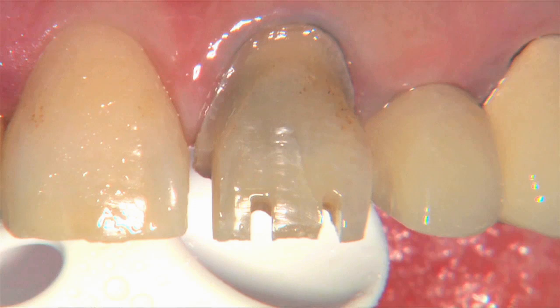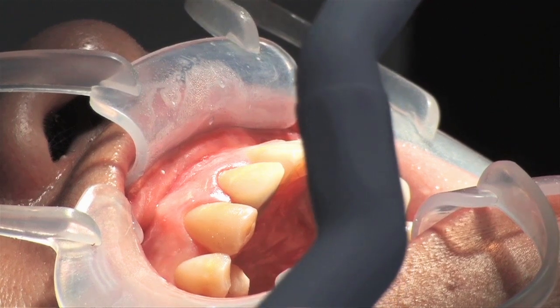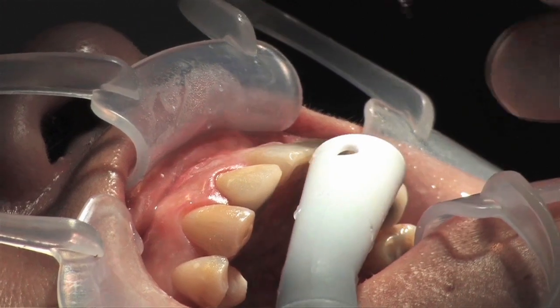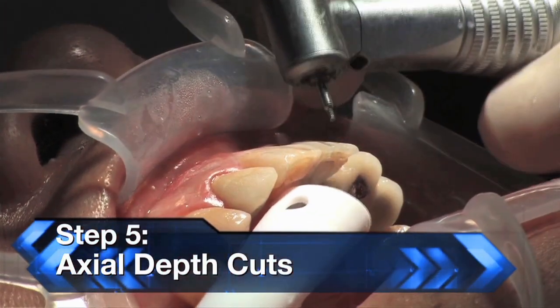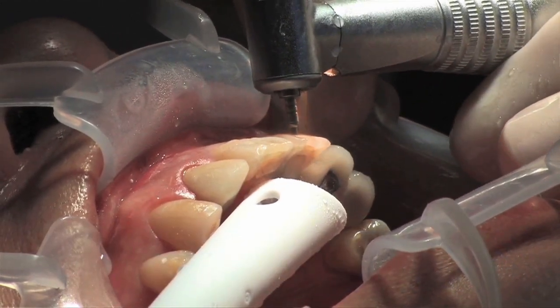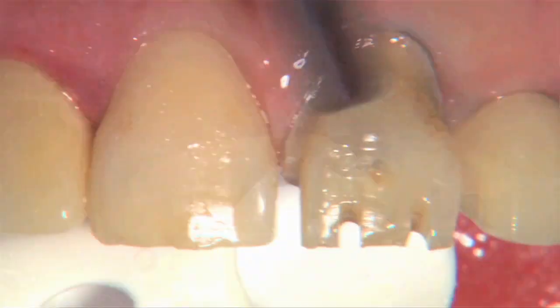So after we put those two depth cuts in there, the next thing we're going to do is go with an axial depth cut, and this is going to be a 1.5 millimeter depth cut that we're going to place just below the junction of the incisal third and the middle third. We don't want to go too far towards the incisal because we'll lose it when we do our incisal reduction. And we don't need to go down towards the gingival because we already have a depth cut with our round bur there. And you can see how I just push it into the tooth like that and it bottoms out and it won't go too deep.